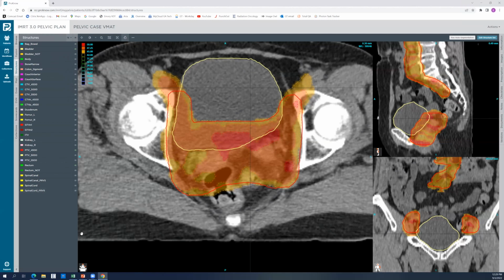Okay, we're dealing also with the fact that we don't have an Opti 4500, which removes those other two PTVs. We're going to have spatterings of high doses throughout the PTV, but we also don't have any way to deal with the bladder itself. So one way to deal with that would be to construct that overlap structure and then optimize to limit the dose to less than 47.25. Put a high priority on that. Make the dose that you want zero volume in this new volume to receive: 0% of that volume should be receiving greater than 47.25 at a high priority.